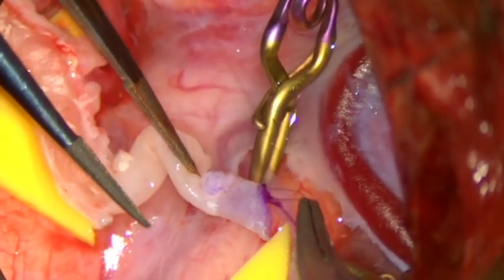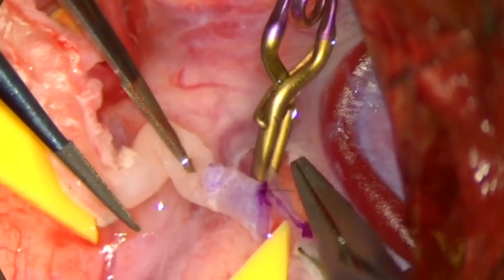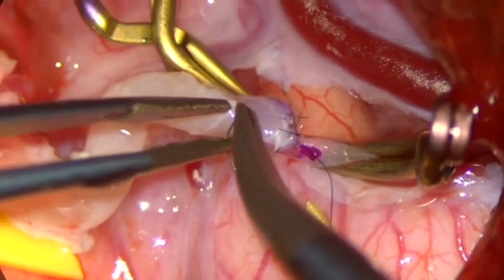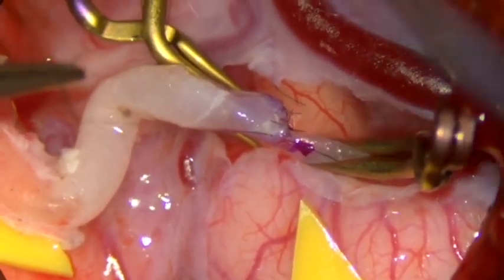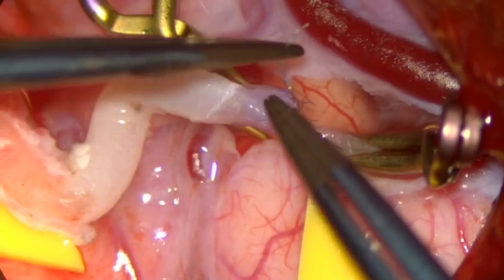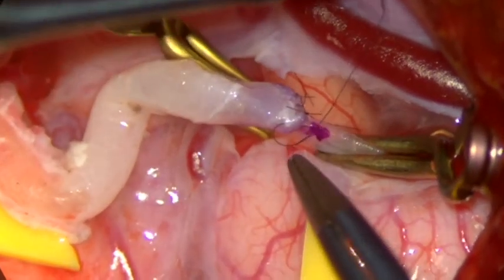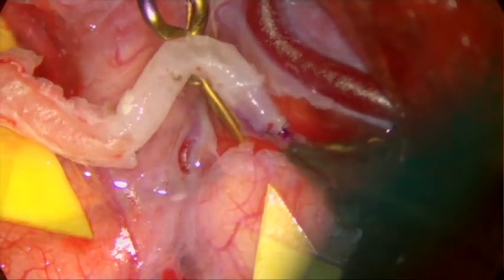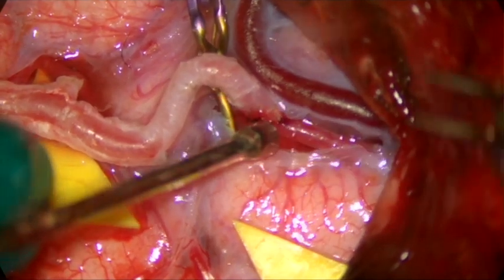The choice is between interrupted and running technique. In this particular case, we used the interrupted technique with the 10-0 Ethilon. After finishing one half of the wall, I turn the STA to do the other side. Upon finishing the suturing, the clips are taken off.